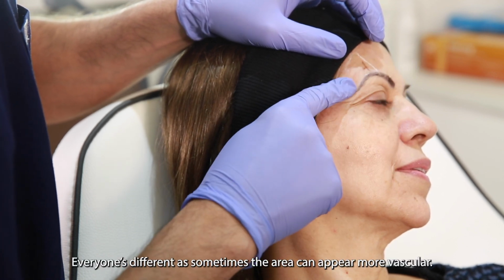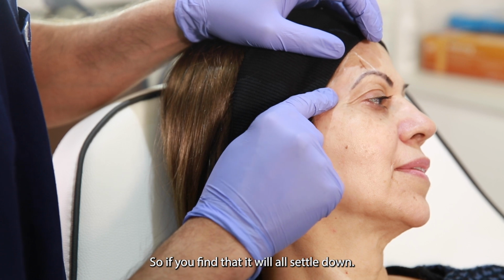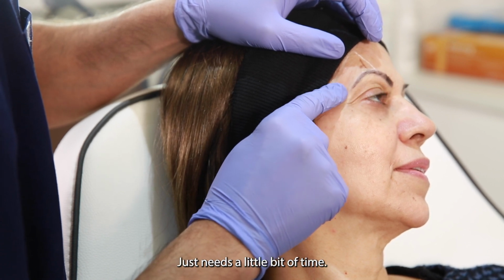Everyone's different and sometimes the area can appear more vascular. So if you find that, it will all settle down. Just needs a little bit of time.